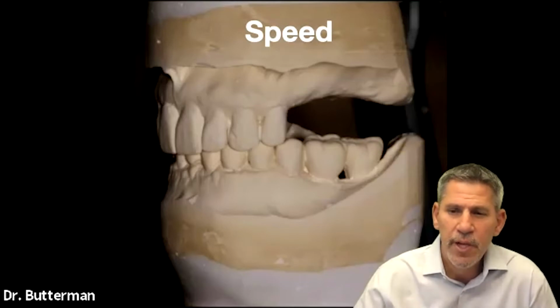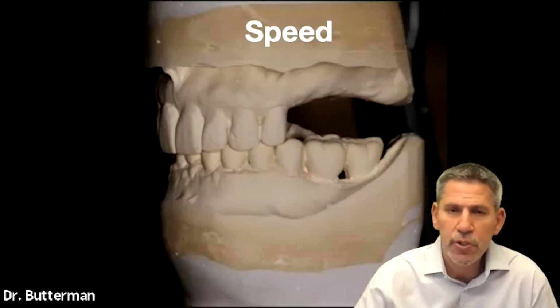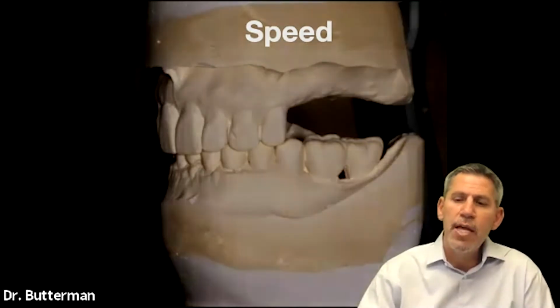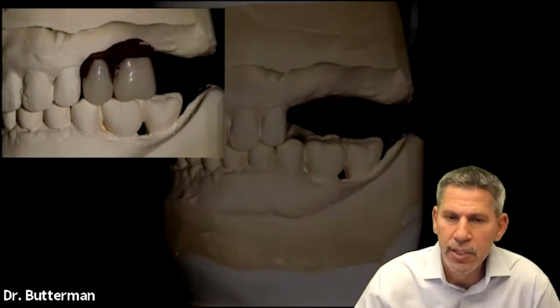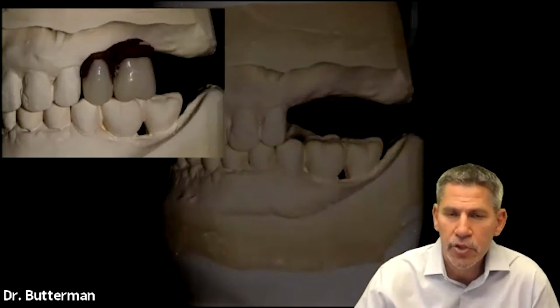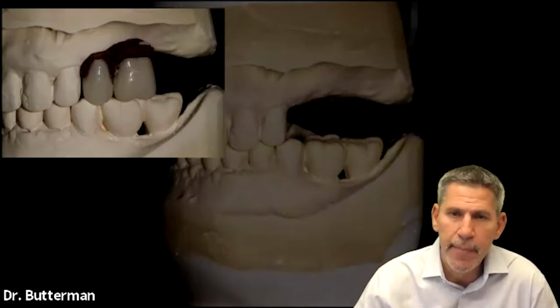So for example, a patient's missing a couple teeth. What do you do? Well, you take an impression, because that's what you always do when you're not sure what to do. After you take an impression, maybe you say, let's send this to the lab and have them do some sort of diagnostic wax up. Okay, now we know where the teeth are supposed to go. That's probably going to take a week or two before they get it back to us.